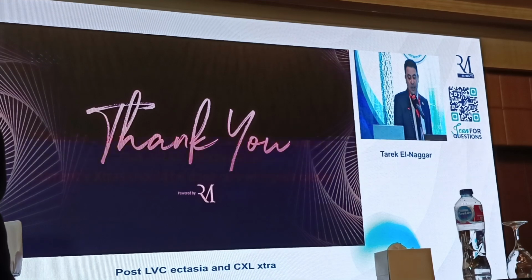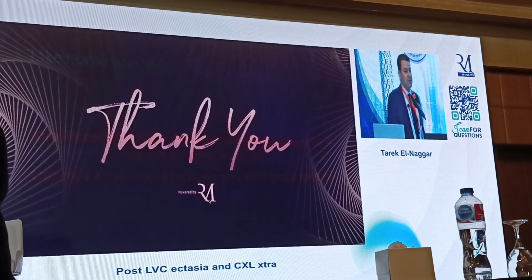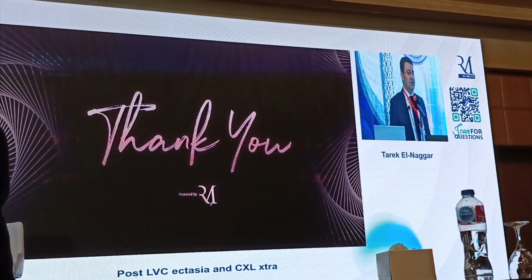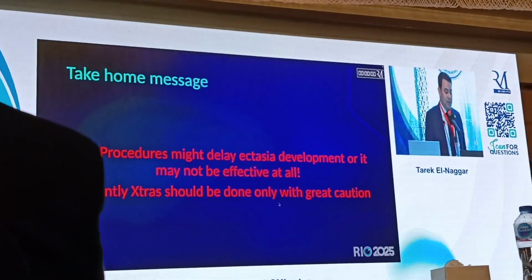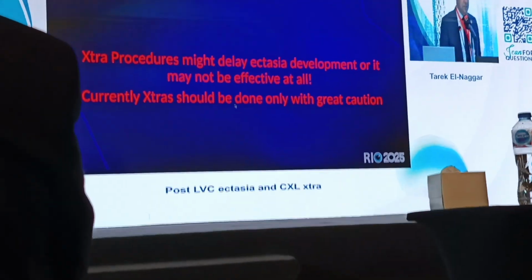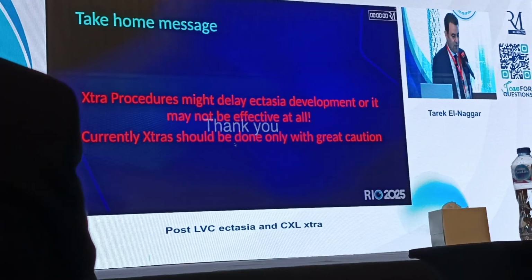Take-home message: Xtra procedure is not effective right now, except after a long-term follow-up, and you should wait. Currently, Xtra should be done only with great caution.